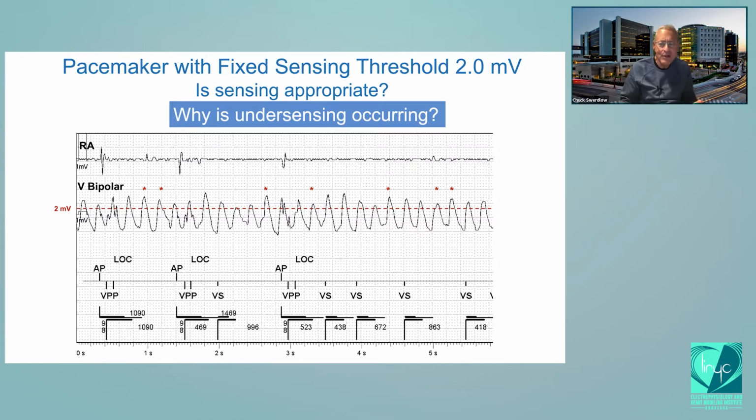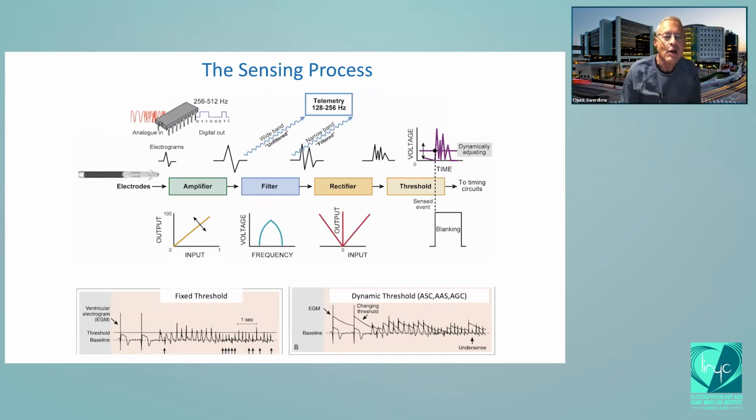Okay, so I have your attention. This was the purpose of this slide, to motivate you. So this gets at the question, what is it that the device actually does? It takes the signal, it amplifies it so it can analyze it more, and it then filters it. I know you talked a little about filters when you talked about pacemakers, but we're going to come back to that. It then rectifies it.